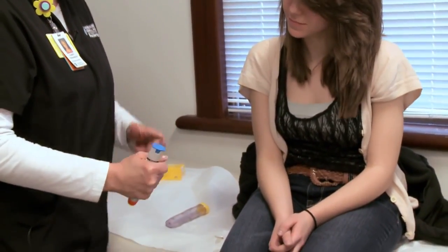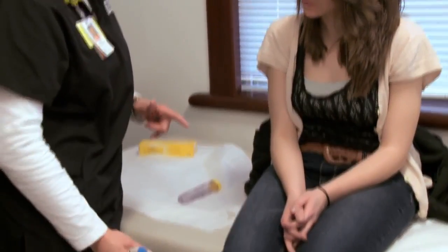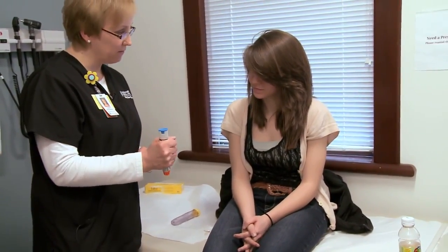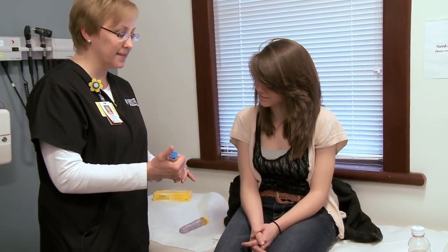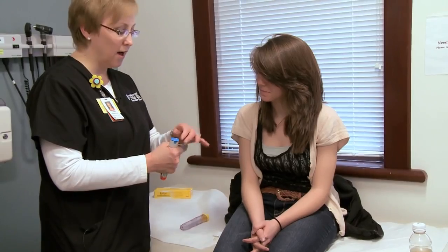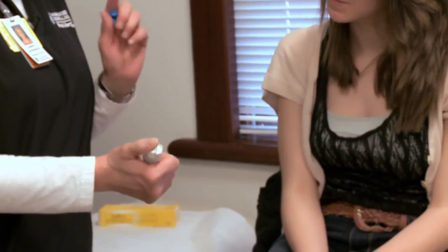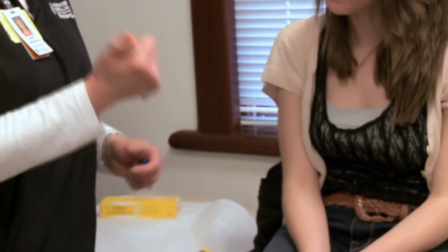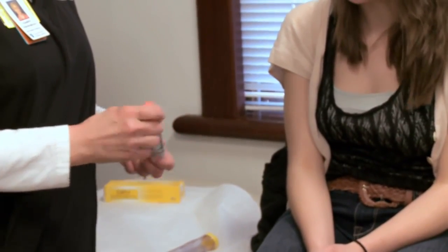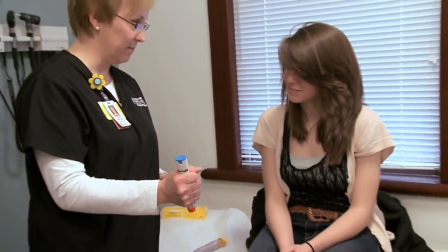Hold it like a fist. The cap has to come off to activate this — if you don't take the cap off, nothing will happen and the needle won't come out. The reason for the fist grip is that people instinctively want to put their thumb there and won't remember to take the cap off. Also, even if you do take the cap off, putting your thumb at that end may stop the device working correctly — and sometimes people put their thumb on the needle end and get injected through their thumb. It really does happen.